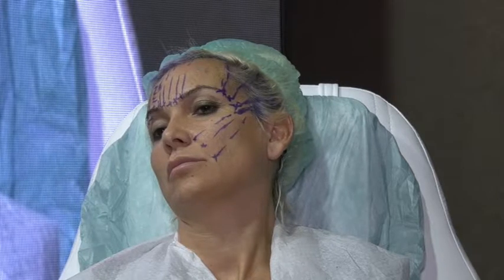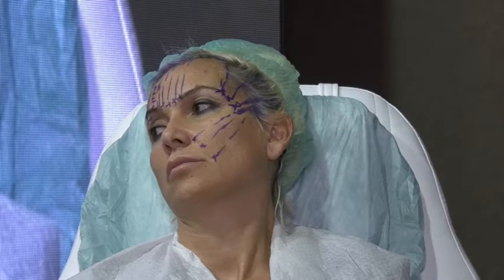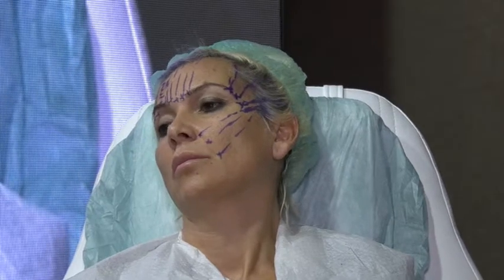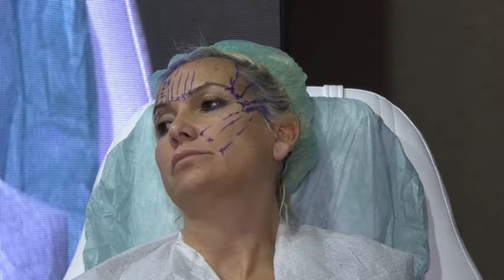I cannot take it all like that. This is a fish. This is a moon face. This is not what we are looking for. We want a definition. We want the patient to have a shape. That's why we separate the vectors of lift. We have a different vector of lift, and the issue will follow the anatomy.